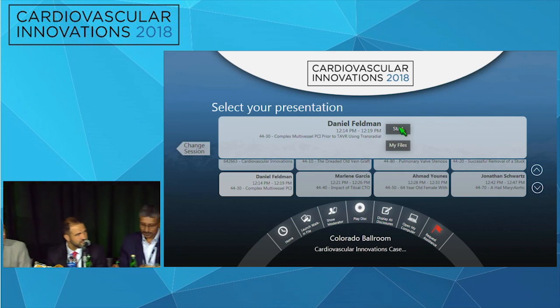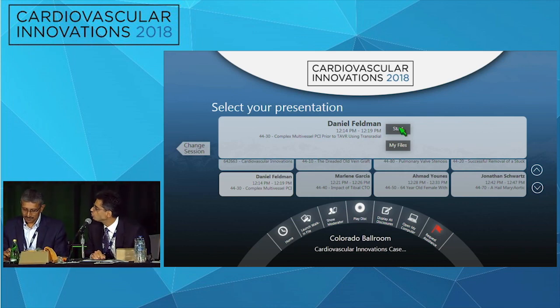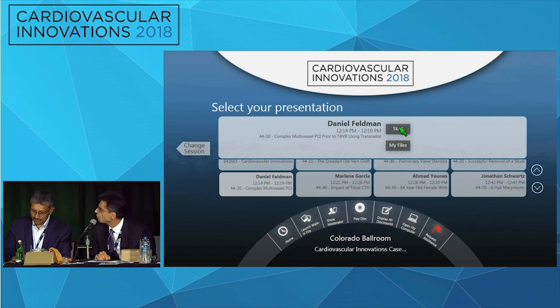Perfect. Excellent presentation. Quick question. Are you worried? If something were to go wrong, I notice you're going 6 French transradial. If something were to go wrong, what would you have done?